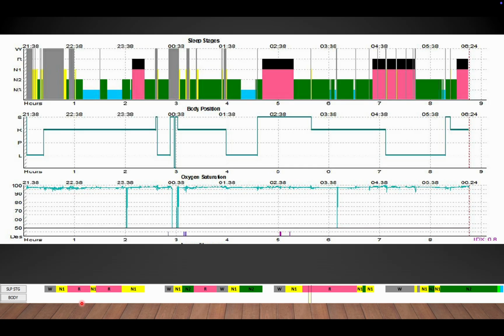Always during MSLT, the first nap SOREM is to be counted with caution, as it may be an extension, or it may be within the patient's natural sleep time, especially if the patient has a delayed sleep phase component. Hence this will be a difficult situation, especially because of this waking up from the middle of the REM sleep.